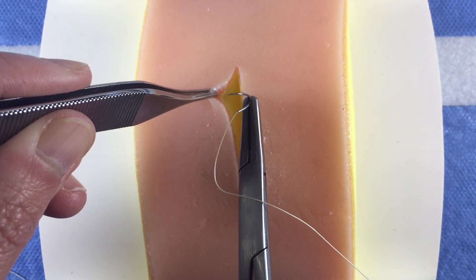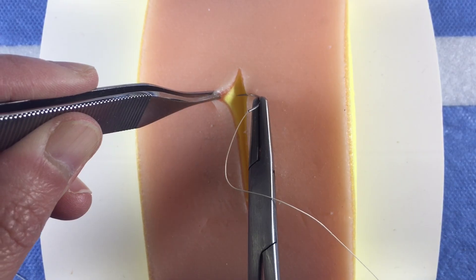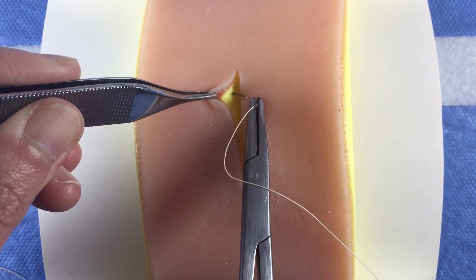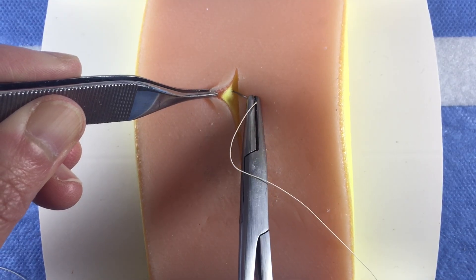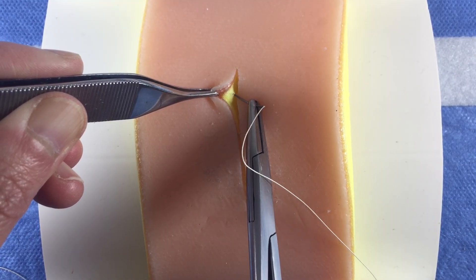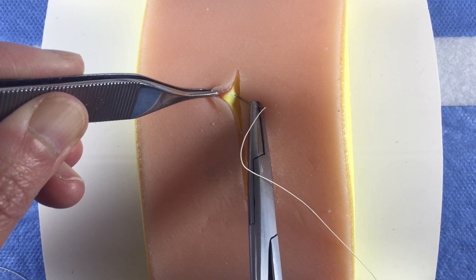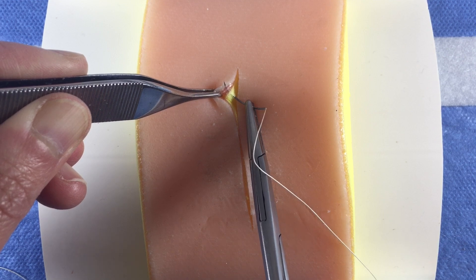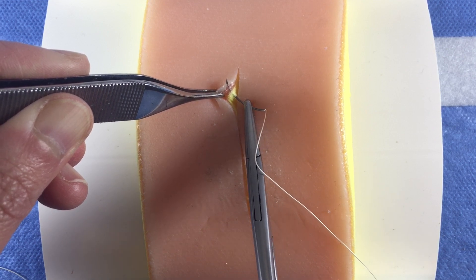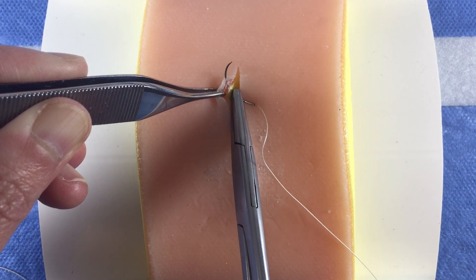Place a vertical stitch going from the deep dermis to the superficial dermis on the non-dominant side. Your suture should come out just below the junction of the epidermis and dermis — the line where the pigment of the skin and the pink of the dermis meet. You want to come out just below this line.